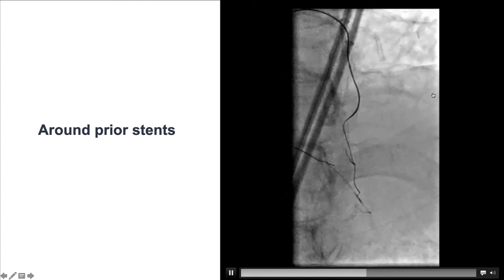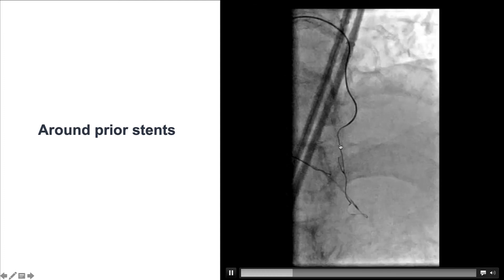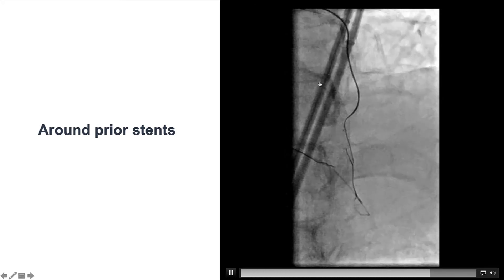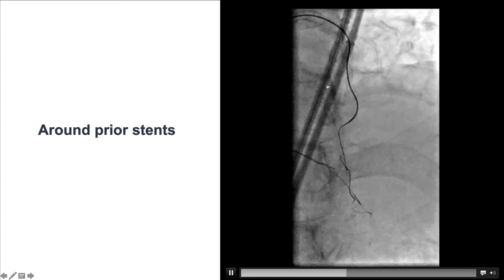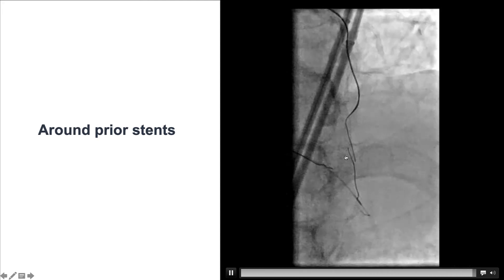We were then able to advance the microcatheter close to the course of the vessel. Of note, the previously placed stents from the vein graft to the LAD were extending all the way from the vein graft into the native LAD, which of course created problems with crossing the native vessel.